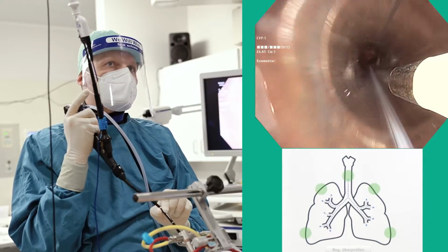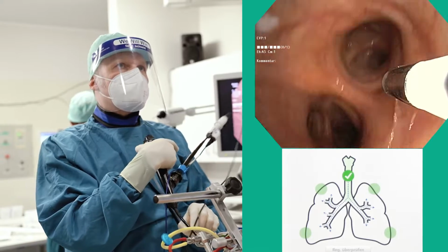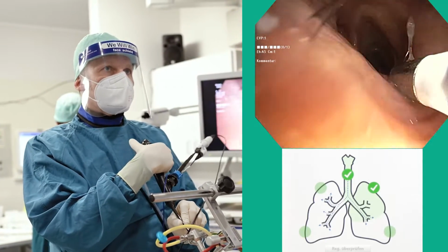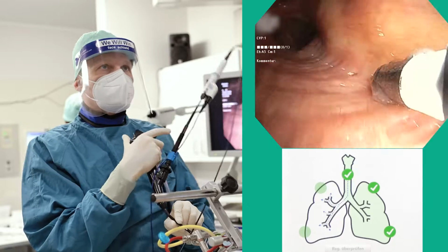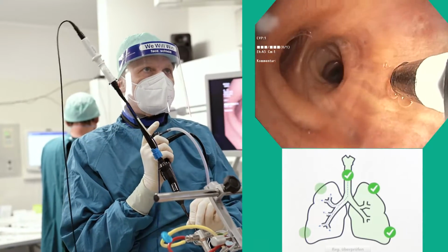Several reference points are marked for automatic registration during the procedure. These are usually anatomical landmarks, such as the main carina. Automatic registration is carried out after initial airway inspection. The previously marked landmarks are reached with the navigation probe until the process is completed.